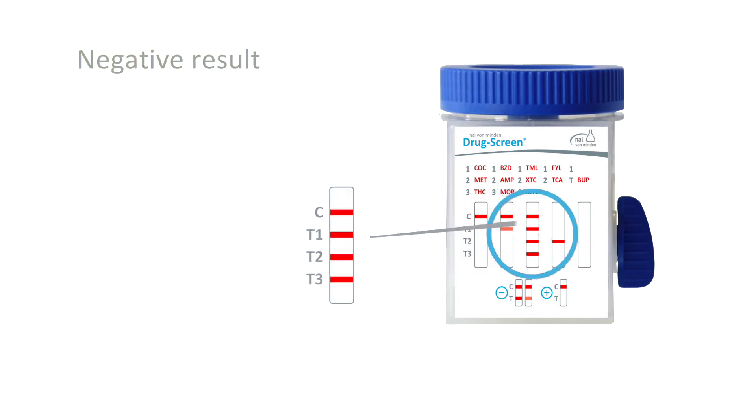A line in the test line region indicates a negative result. Again, a control line signifies that the test has performed correctly and should always be present.